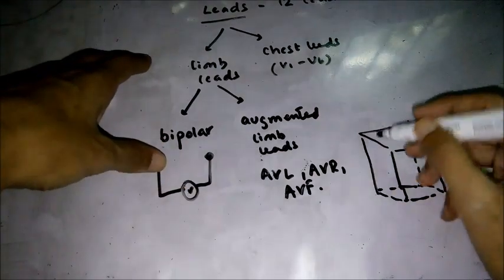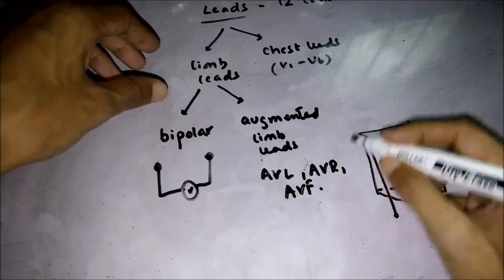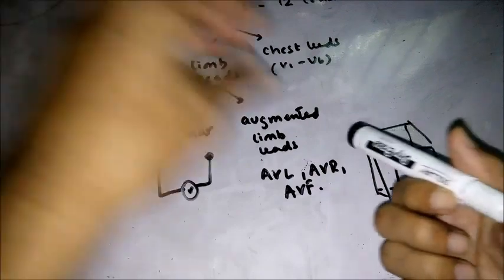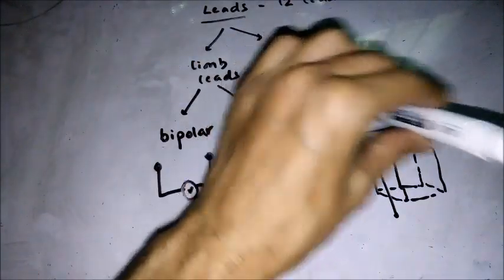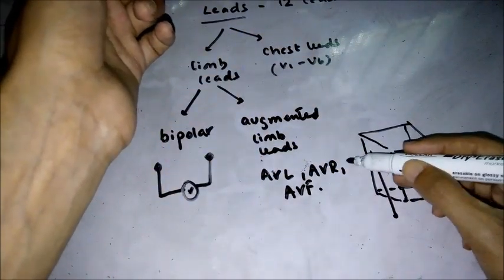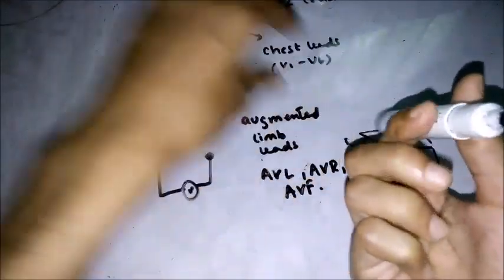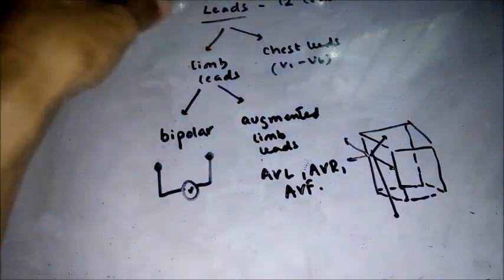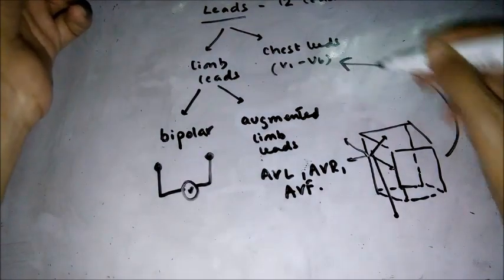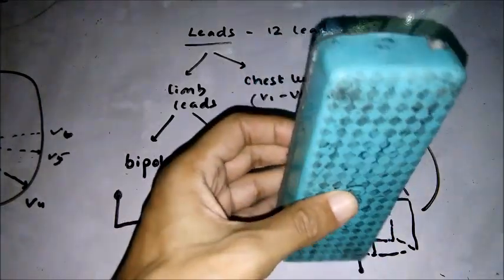What the limb leads are doing is giving us a representation in the downward direction, upwards, in more of a 2D axis, but they're not telling us about the electrical activity that is coming outwards, right? And in order to know that, we need to take help from the chest leads. So the chest leads are telling us about an outward axis orientation, right?